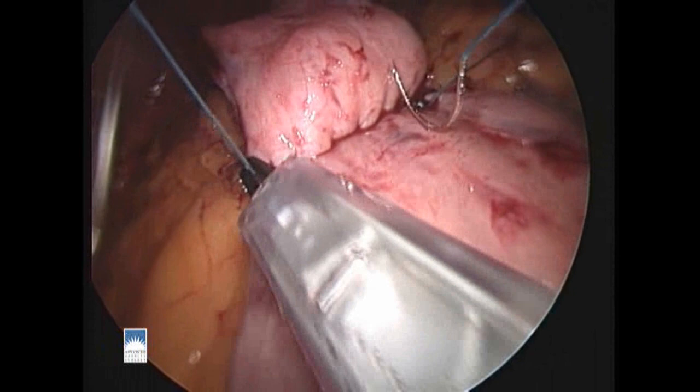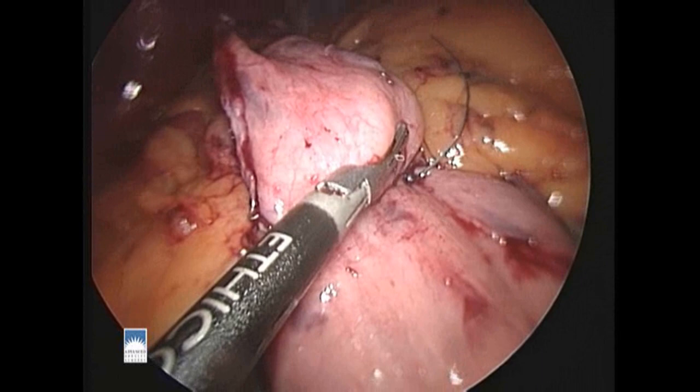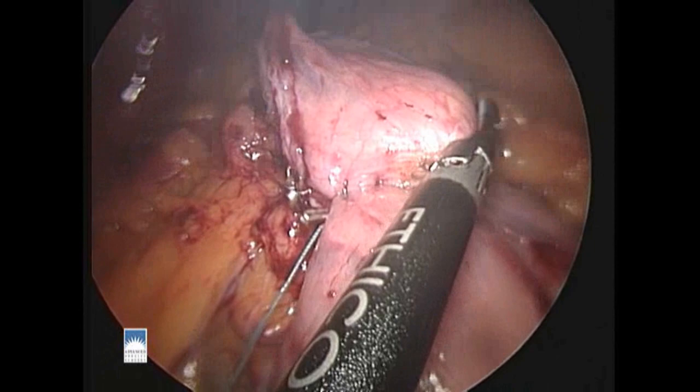Here we're securing the back row suture but we'll come back to it later. Now we're going to make an opening between the stomach pouch and the Roux limb and continue on with our sutured anastomosis. We'll use a different colored suture for the inner layer of the anastomosis.